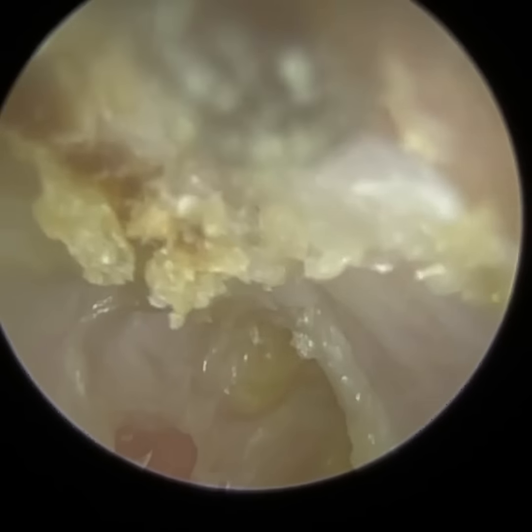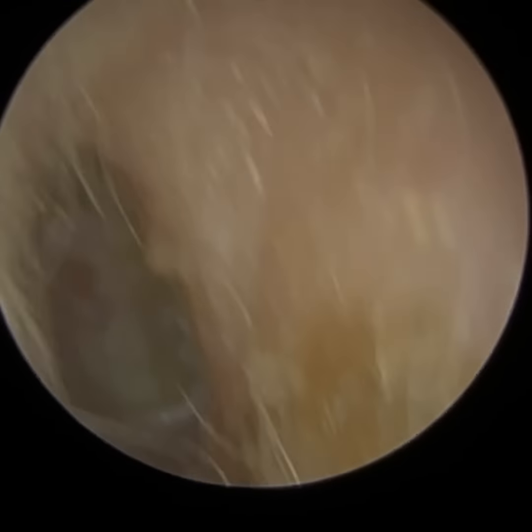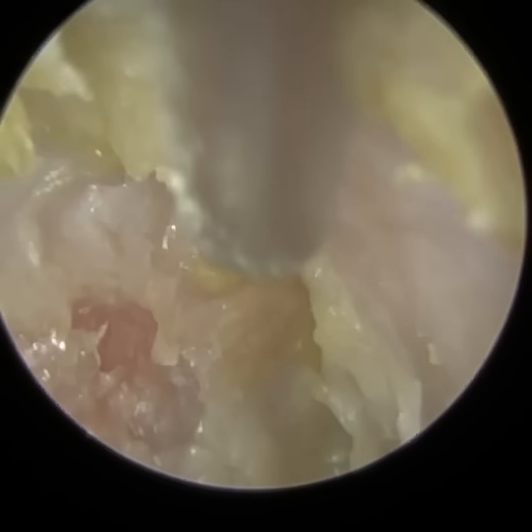So I'm just going to the top of the ear canal. I'm trying to peel this down. It's a bit more crusty here. So we can partially see the eardrum around 10 o'clock.